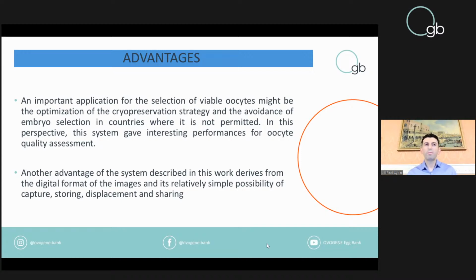Because sometimes it happens, I will be honest: you load the straw with oocytes, and the next clinic warming the oocytes may say, no, there was one oocyte. So it's possible. Yeah, I understand that, because everyone has different experience. When you go directly into the solution, sometimes the concentration is very high and the oocyte just flies out, sticking near the wall of the four-well dish.